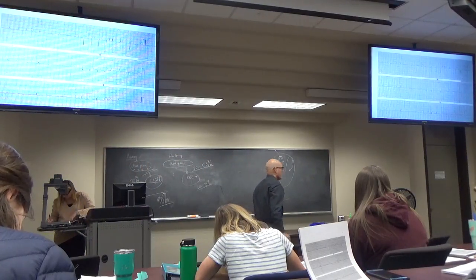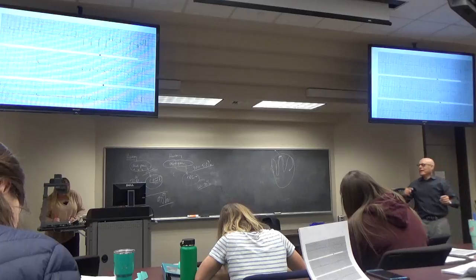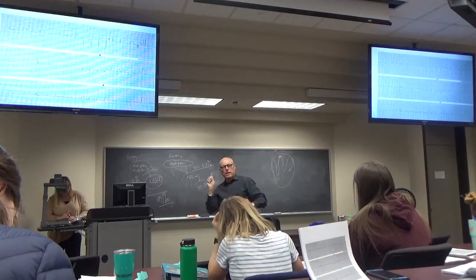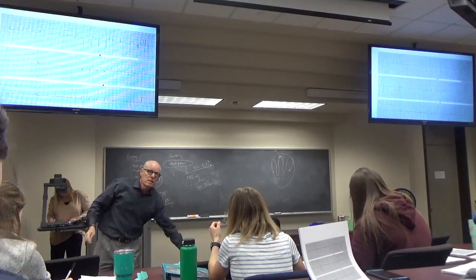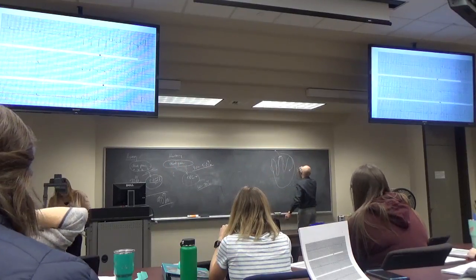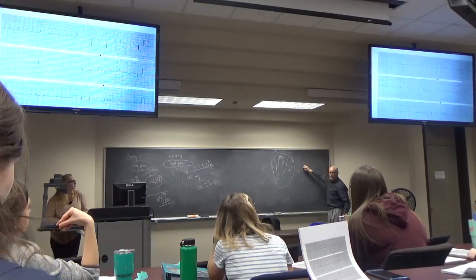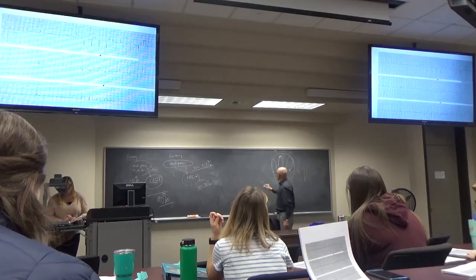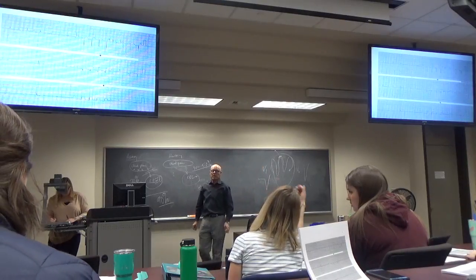Okay? So look at those. We don't know where that thing is. We don't know where that bypass is. It could be anywhere within 360 degrees. It could come down and hit the ventricle from below. It could come over and hit the ventricle from the top. It could come around and hit the ventricle from the sides. We don't know where it is. If you were V6 and you saw it here, what would V6 look like? What would the ventricular depolarization curve look like? Electricity's going away from it. If it was here and you were V1, what would it look like? Electricity's going away from it.